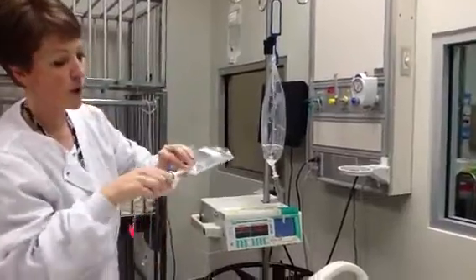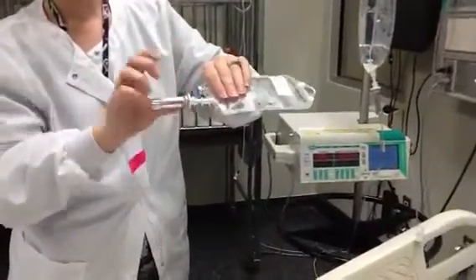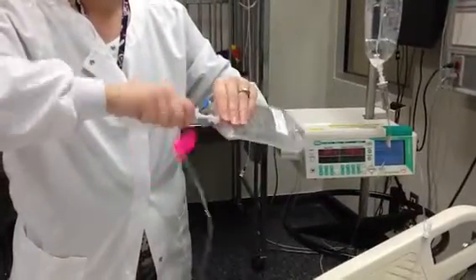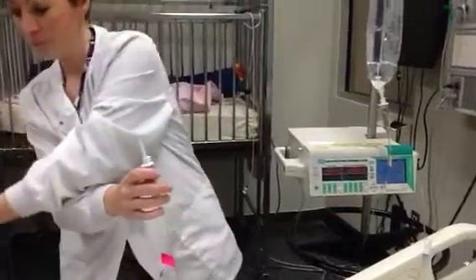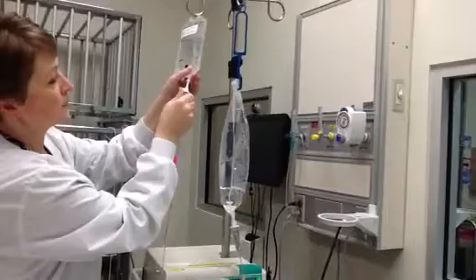What I'm going to do is I want to disconnect my old bag from my IV tubing, but when I do that, I want to make sure I maintain the sterility of my spike. So I'm going to take my spike out and now connect it into my new bag.